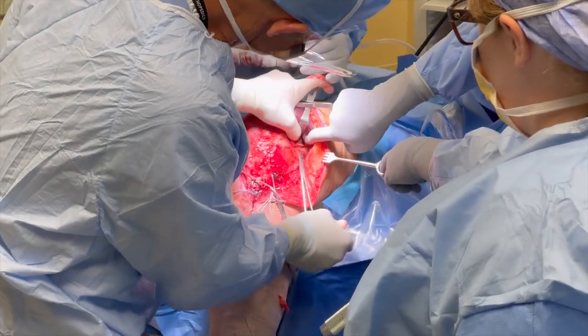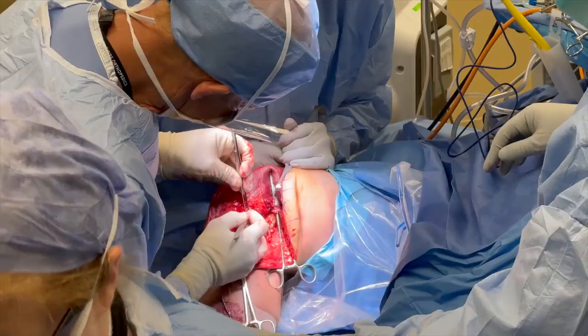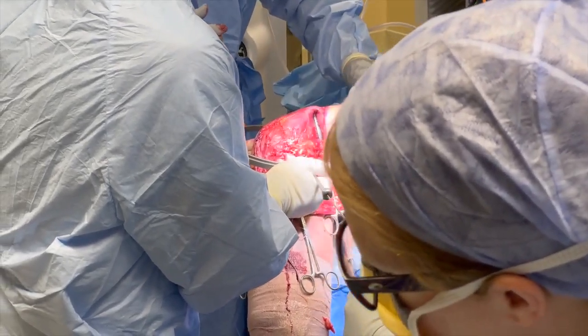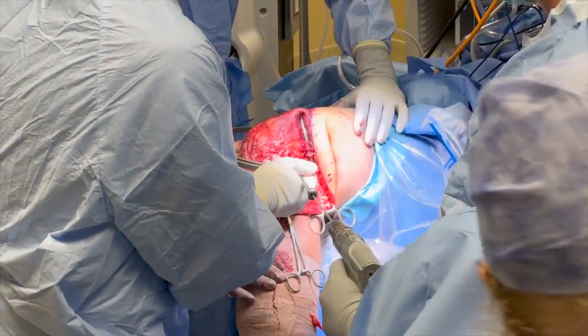Attention is now brought to the femur. The adductor magnus tendon is identified first to identify the adductor tubercle. From the adductor tubercle, measuring 12 mm distal and 8 mm anterior helps to identify the medial epicondyle. The MCL femoral attachment is located just posterior and proximal to the medial epicondyle. A guide pin is drilled anterolaterally across the femur at this location.